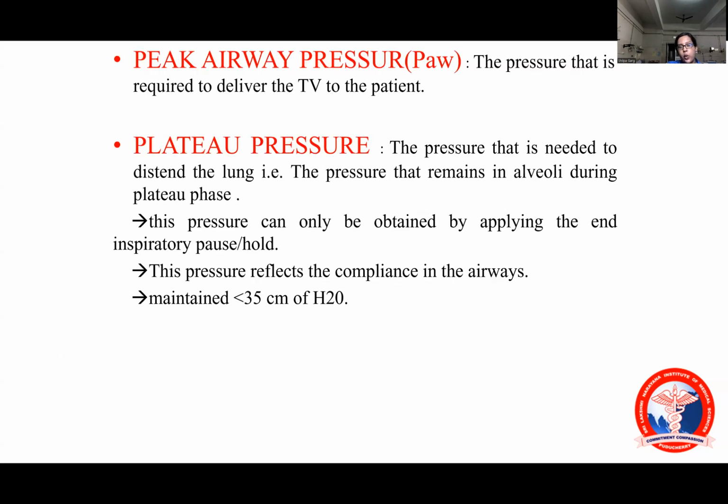Peak airway pressure is the pressure required to deliver the tidal volume. It is like a positive airway pressure. So you are pushing the air into the lungs.